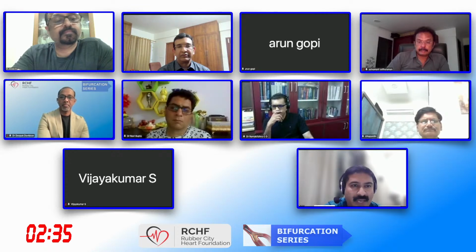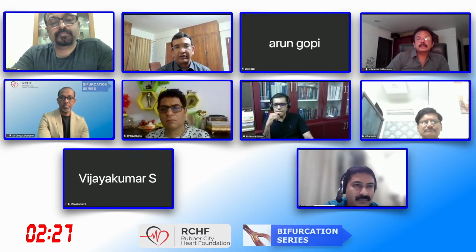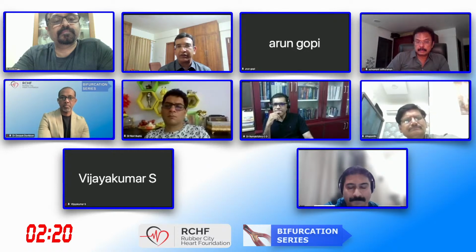What other option do I have with this narrow angle and me having a chance to miss the ostium if I try a mini crush? Then I would be ending up with yet another stent. So I thought I'll just... DK would have been good here, isn't it? DK crush, because you didn't want a closure of the side branch.